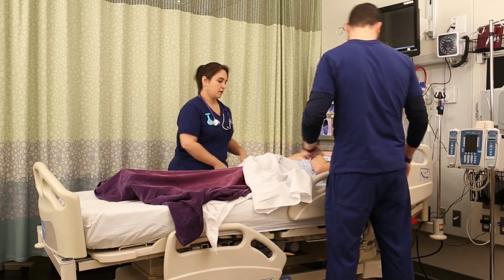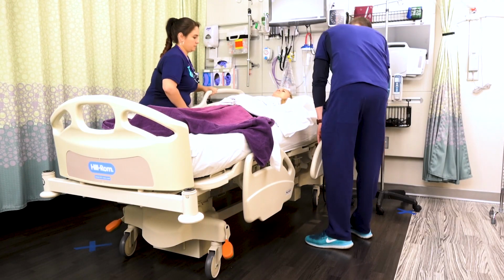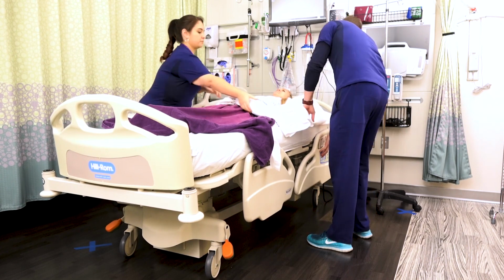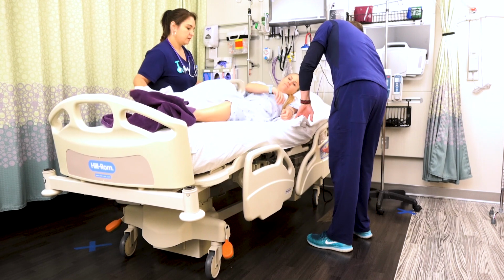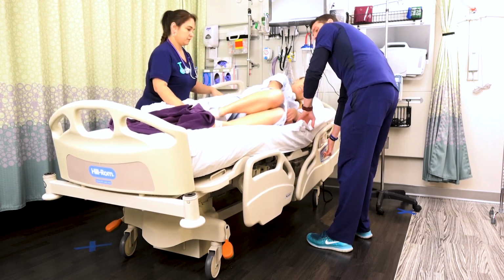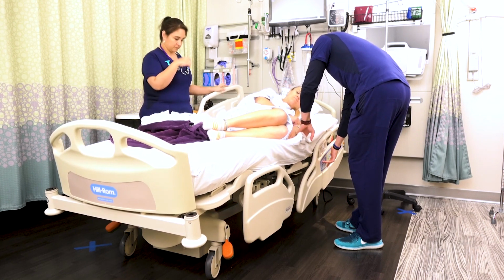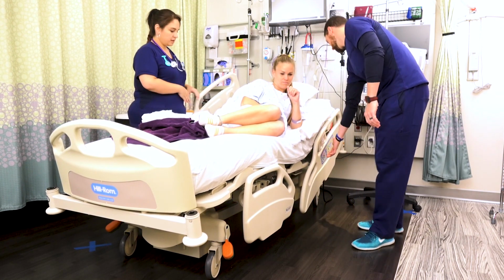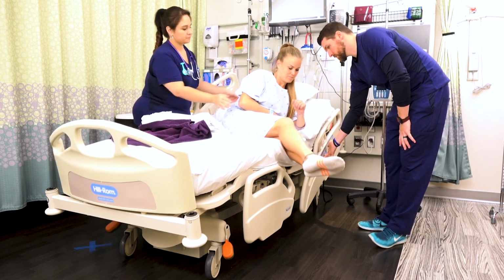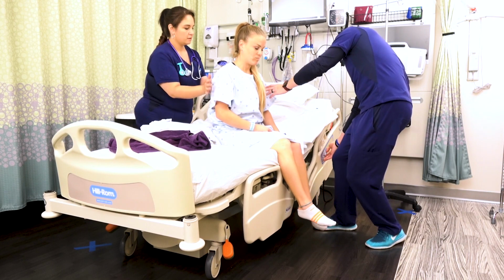Now, let's say we want to get the patient out of bed. First thing we need to do is put the side rail down and have the patient turn towards you onto their side, and of course put the bed down lower to the ground. Once we're ready, we want the patient to lift themselves up onto their elbow, and then they want to turn up to sitting as they swing their legs over the side. You can help them move their legs if needed.